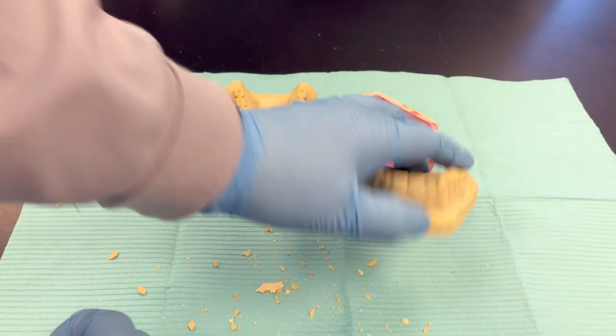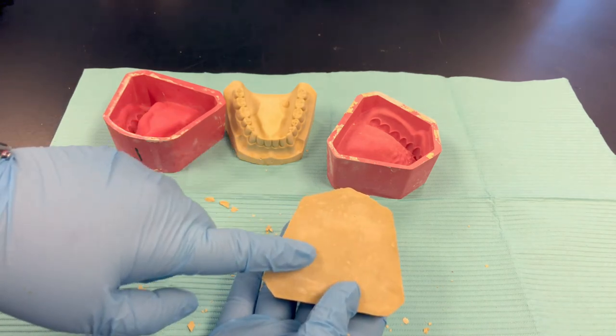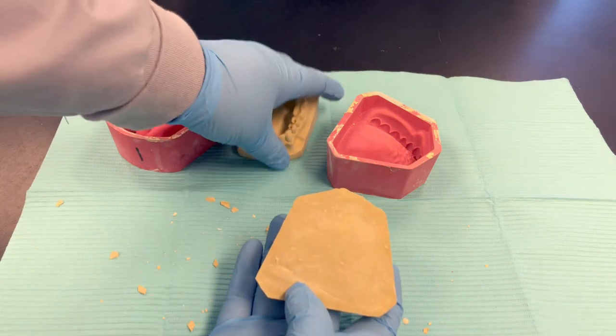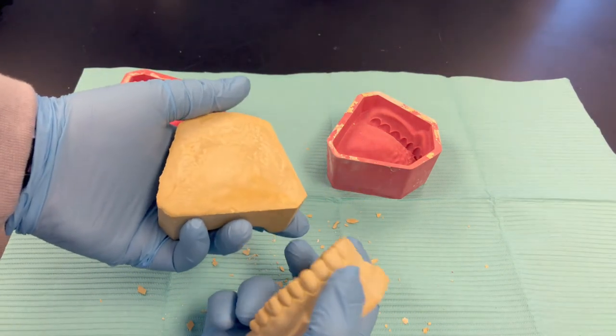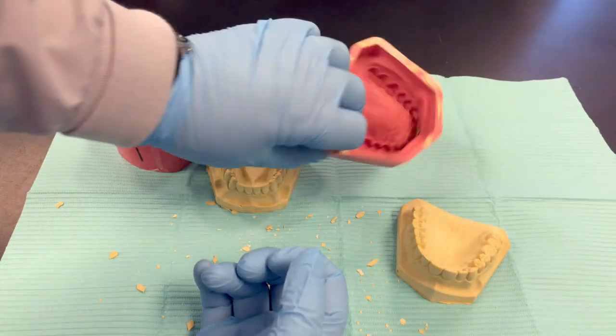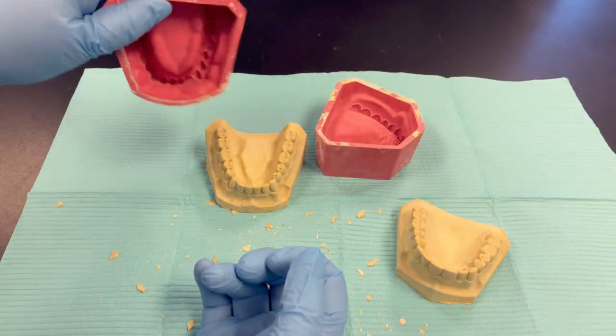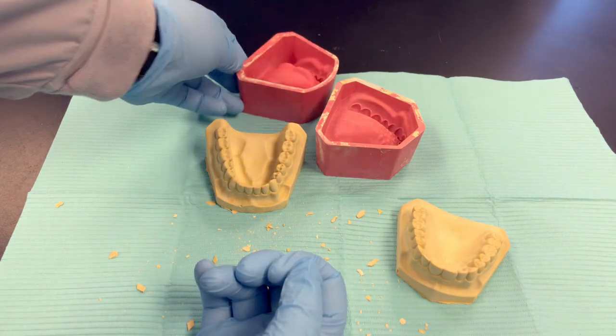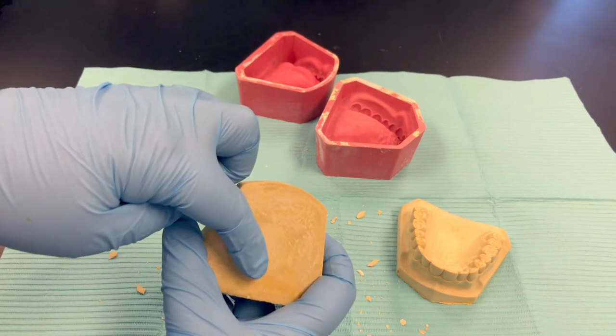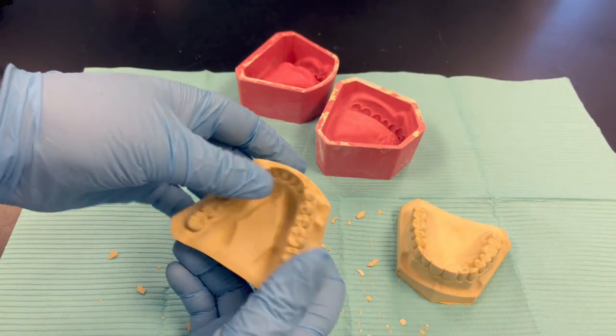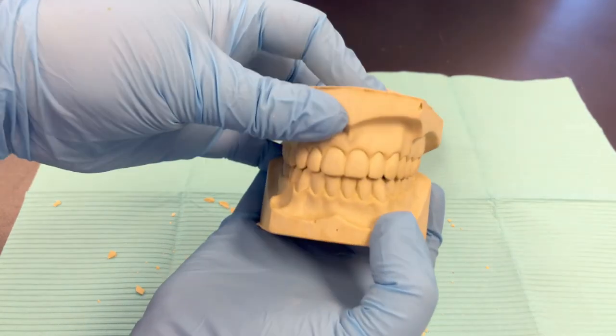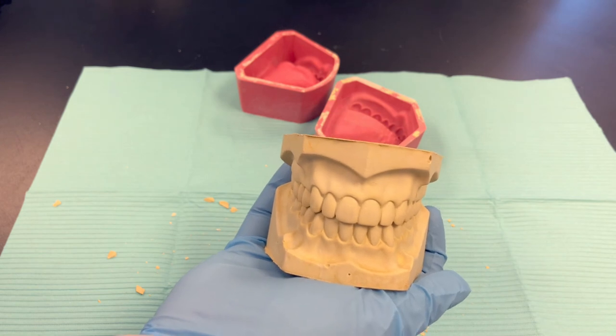With your study models, always write the patient's name and the date of the impression on the study model. That way, in an office with many of these lying around, you know who they belong to. So again, these are just generic rubber molds used to practice our technique. If you're a student pouring this up, put your name on here so your models don't get confused with another student. And here we have a set of stone study models.